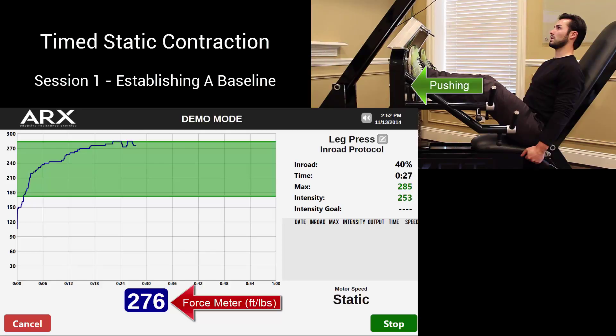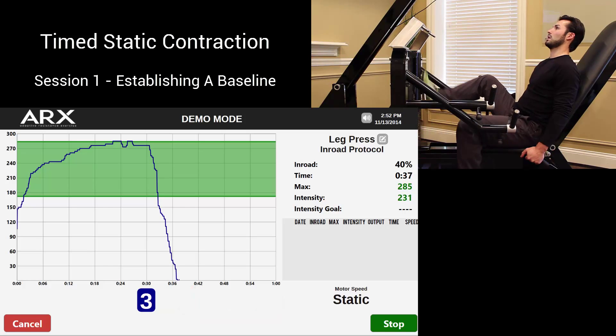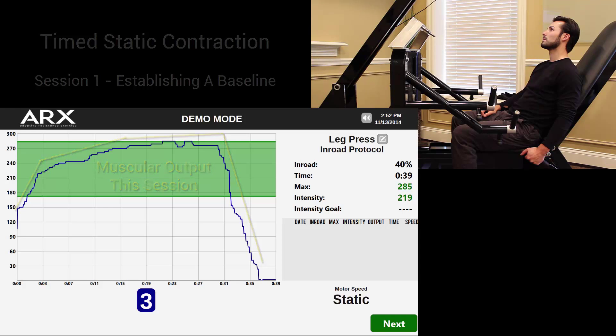For the purposes of this demonstration, the patient will continue the exertion for about 30 seconds, at which point the set is over and he slowly lets off, then he can stop and press the stop button. As you can see, the software has precisely quantified his muscular output and his rehab is underway.